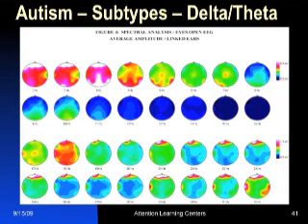This is somebody, these are individual circles. Each of these circles is one speed, so this whole top line is some of the daydreaming. The delta, which are the slower numbers, 1 to 4, are all red here. And that's somebody that had a lot of delta, like that hyperactive type.